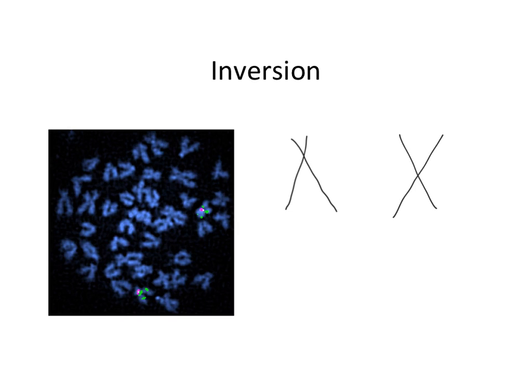So this chromosome in the lower half of the panel is the one that I'm going to designate chromosome A. So I'm going to call that chromosome A, and I'm going to call this one chromosome B. And we can already tell that they're a little bit different, because despite having the 2 fish signals, which suggests that these are homologous chromosomes, they have different shapes. Chromosome A looks submetacentric. Chromosome B looks metacentric. In this case, the white dots that I've drawn on this panel represent the location of the centromere.